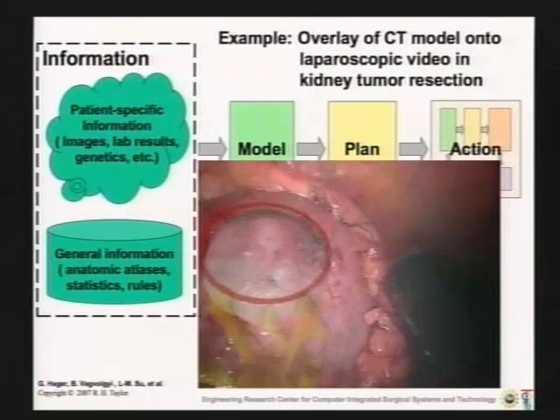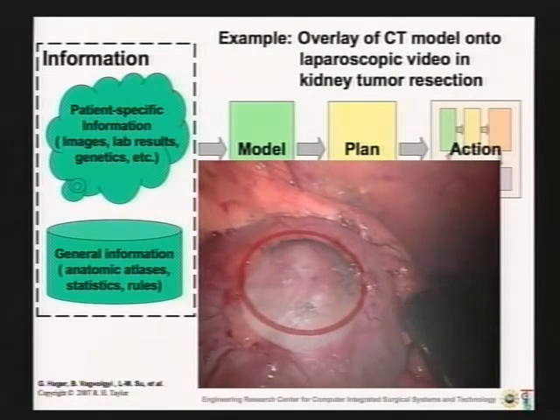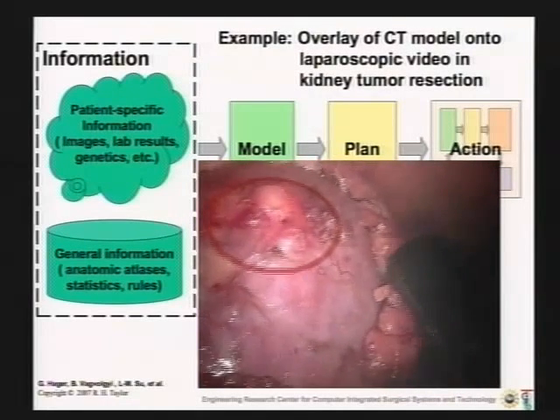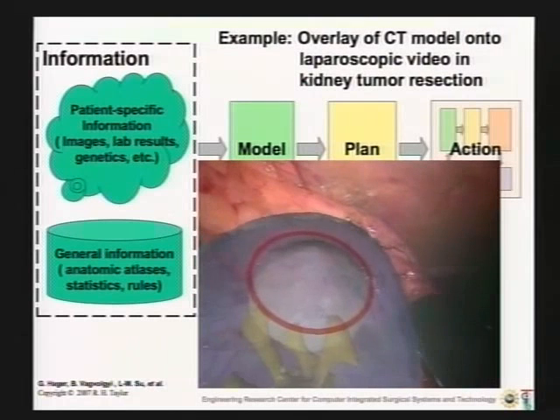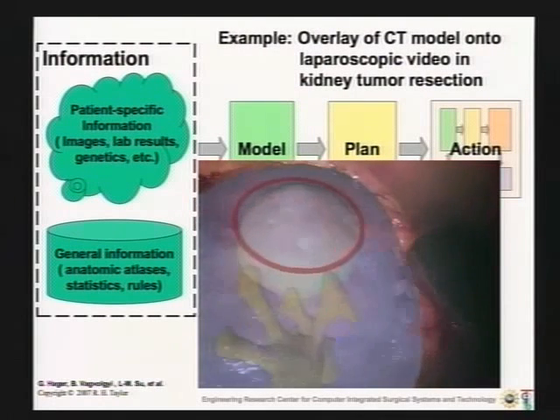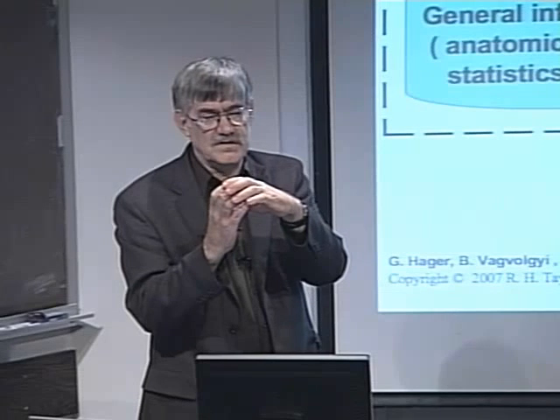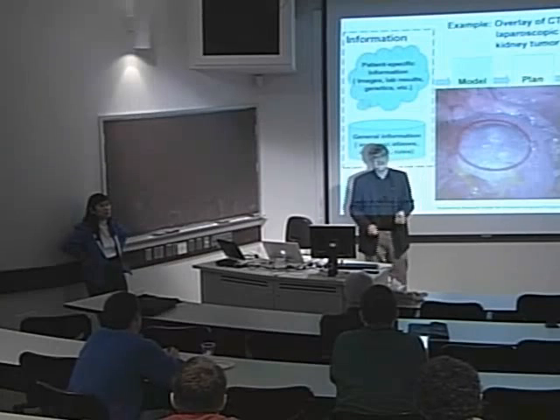Well, the kidney is moving. I mean, he's operating on the kidney, and there is a little bit of tracking delay. This was a first result done with fairly naive implementations. I should mention there is some similar work that's not using vision tracking at CASE. Where you would be using this is you're looking at a display that would either be like a mono or stereo display up on the wall, or in the case if you were using this with a DaVinci, you'd be looking through the DaVinci eyepieces, and it would look to you like you're stable, because also, you know, you're tugging and pulling on the kidney, and that's the motion you're seeing, really. So all of the motion that we're seeing, I mean, because there's relative motion of the red circle with respect to the kidney.